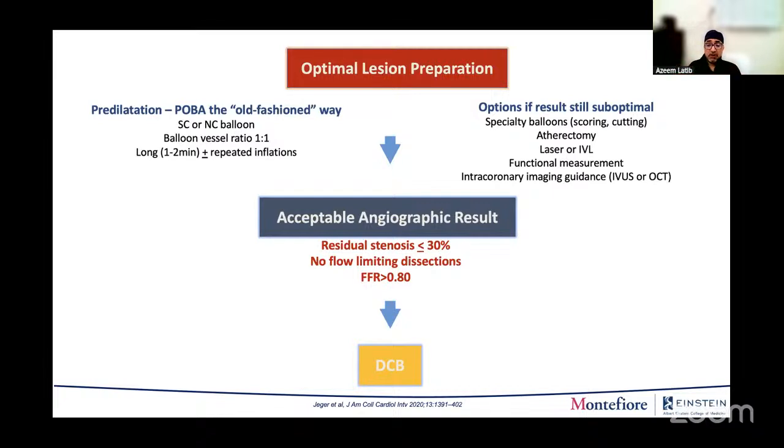A couple of things not to do: hold it further back. Don't touch the balloon. Don't put the balloon in saline or in your saline flush. Don't wet the balloon; it doesn't help to make it go quicker. Just try to hold it really far back. Load it on your wire, get it all the way to the co-pilot, and then I make sure my tech has the wire.